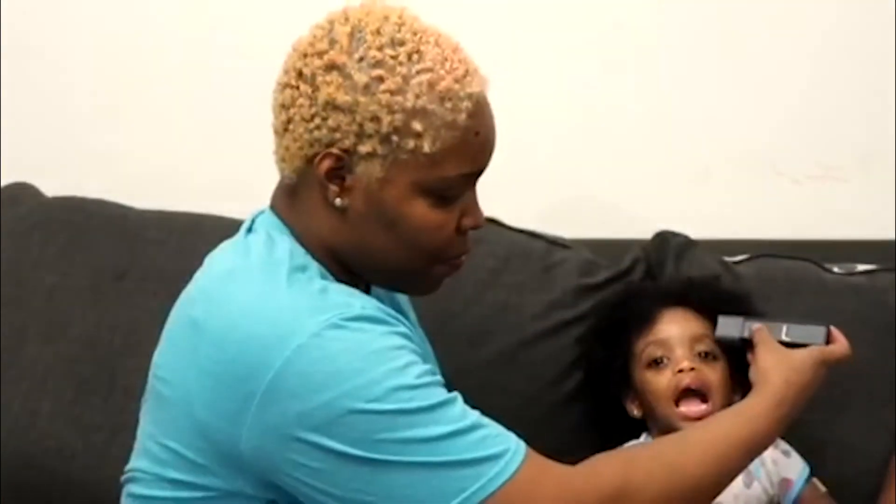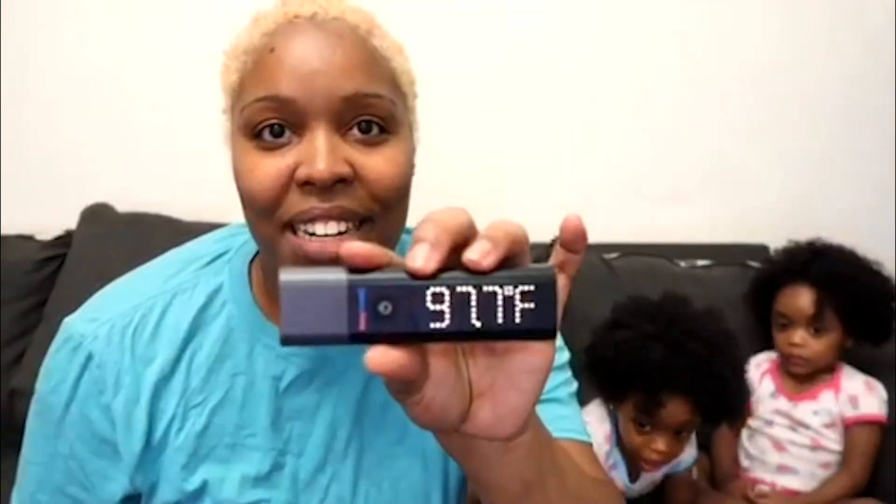The great thing about this is that we can take temperature readings via the forehead and also via the ear. Okay babe, you are first. Bailey's temperature reading is 97.7. And then I'm going to go ahead and detach the top and then I'm going to do an ear reading with Brielle. And Brielle's temperature reading is saying 97.6.